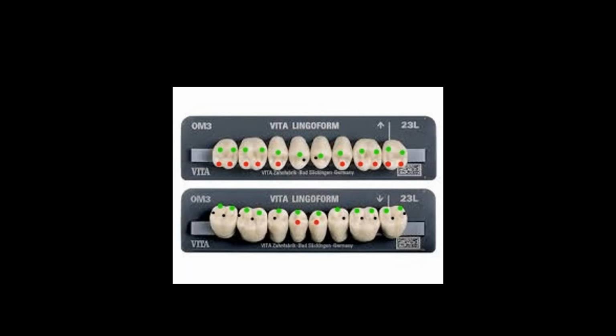And I have to tell you, I do not get the complaint anymore of "I can't eat lettuce." That was a big one for me when I left school, and for the first 5-10 years people complained they had trouble eating lettuce. Now I've eliminated that problem with these teeth because I've realized that these are mortar and pestle, whereas all the other denture teeth on the market are milling teeth. So this has worked well.